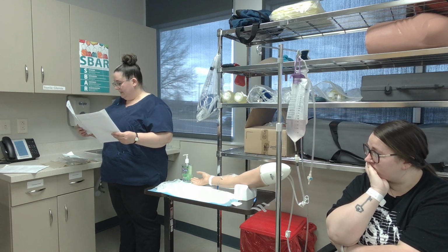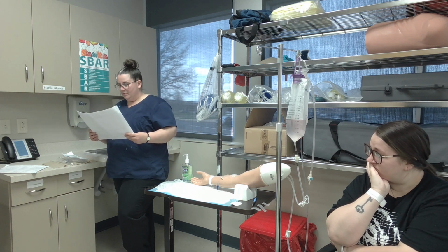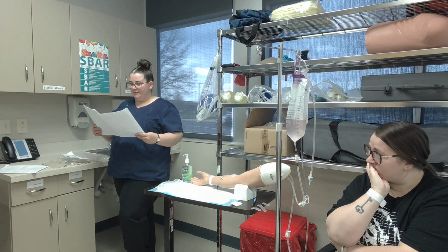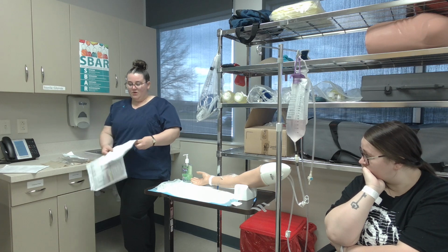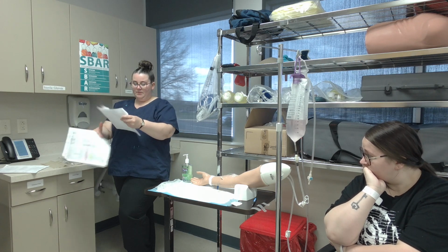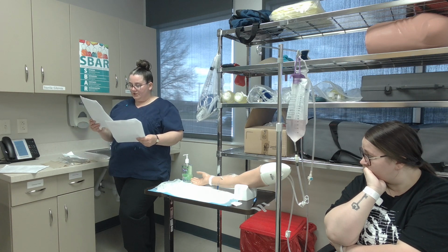And my second medication is going to be for Mr. Joseph Smith, 10/5/1954. My normal saline flush, 3 ml IVP PRN for IV patency.